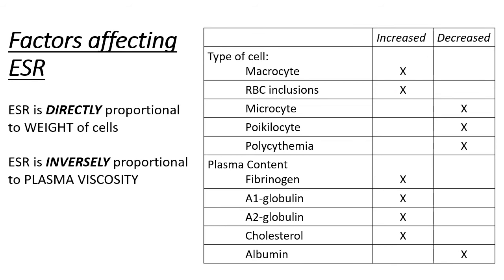Then, let's proceed with the factors affecting your ESR. Aside from the conditions I mentioned, di ba sabi natin, halos lahat ng conditions will increase ESR except cachexia, congestive heart failure, and newborn patients. Dito naman tayo, type of cell. As a rule, ESR is directly proportional to the weight of the cells. Okay? Mas mabigat, mas mataas ang ESR.